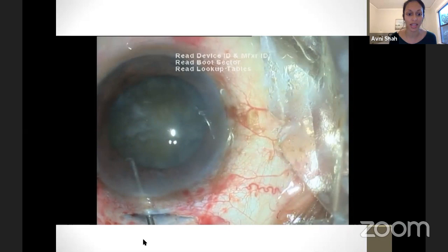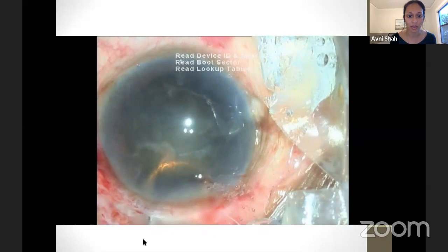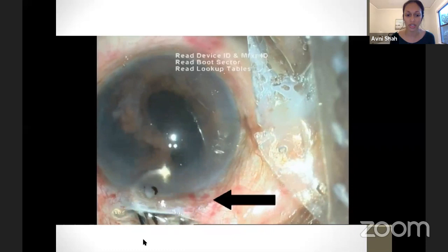And so the most important thing really is, if you think your tunnel may be too small, prolapse the nucleus into the anterior chamber and then assess, is the width of my nucleus going to come out through the width of my tunnel? And here you can see there's a huge discrepancy between how large the nucleus is and how wide the tunnel is. You can see they're struggling trying to get the nucleus out. At this point, you really should go in and enlarge the tunnel, but they're continuing to try. Some iris was incarcerated in the wound, and you can see they've caused a huge iridodialysis, and that's not nice.